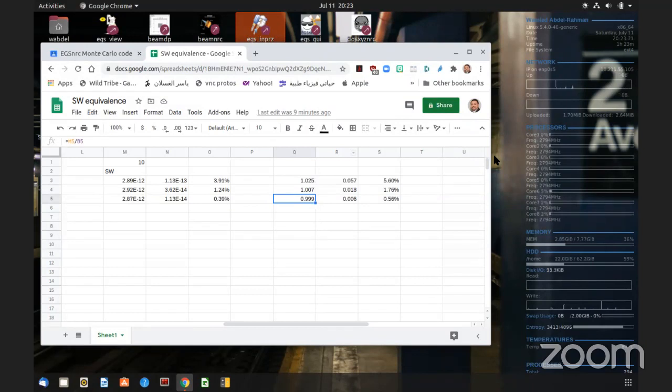I haven't done it because usually I do the TRS in water, but I think it has a section that if a user wants to calibrate the beam in polystyrene or solid water, it gives you a correction factor. And those correction factors, how do you think people obtained them? It's through Monte Carlo. Monte Carlo, yes. This is exactly what they do.